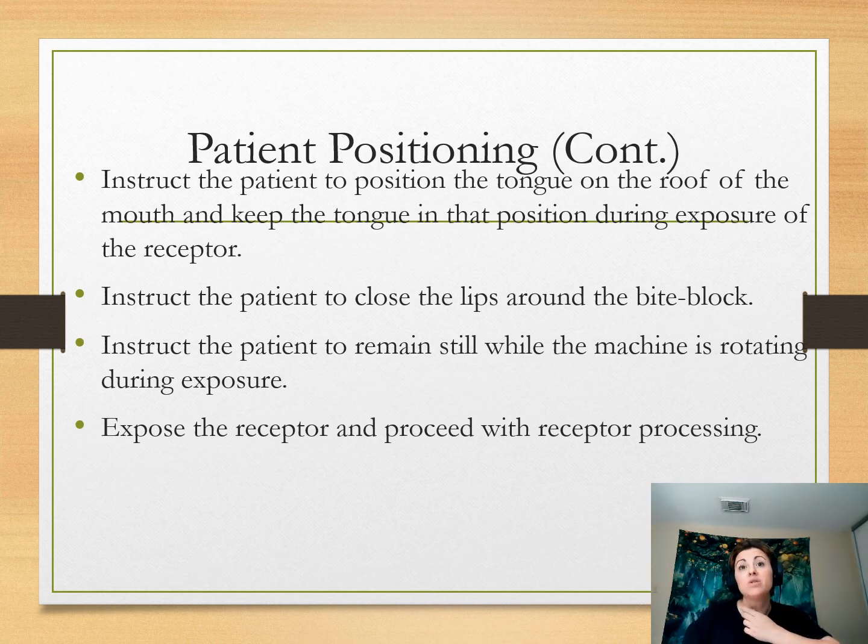So it's important that you tell your patient either close their lips and swallow, or close their lips and place their tongue to the roof of their mouth. Sometimes people will do this thing where they just place the tip of their tongue to the roof of their mouth. You don't want that, okay? You want them to completely fill the space of their mouth with their tongue so they don't have any air in there.